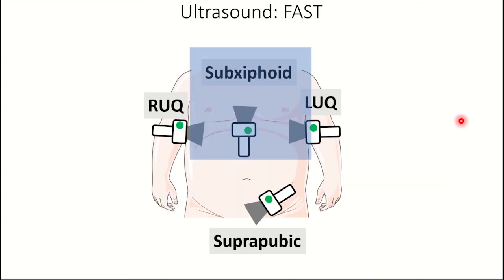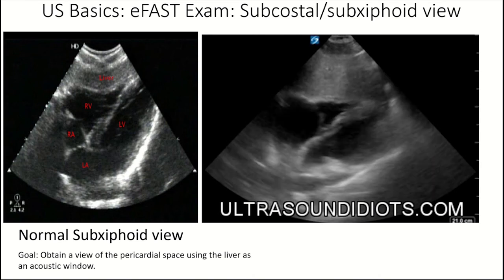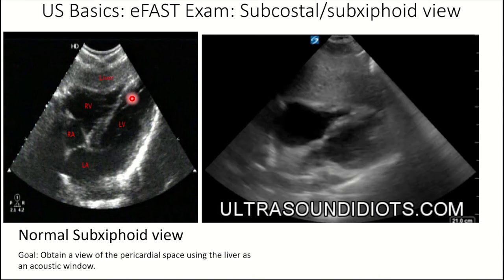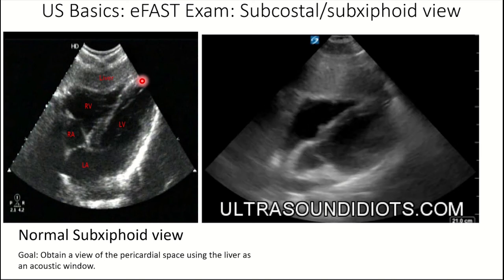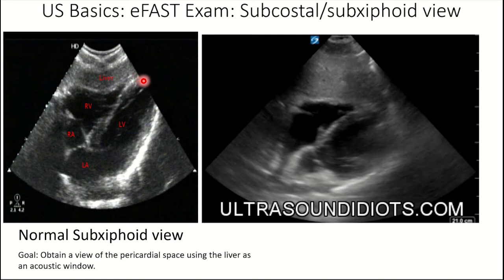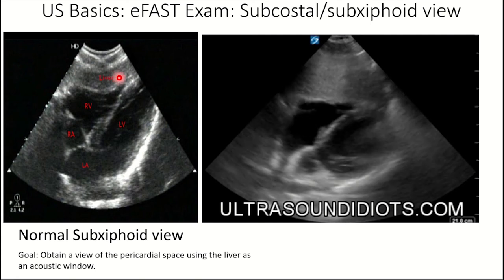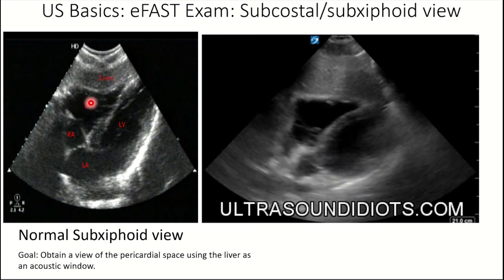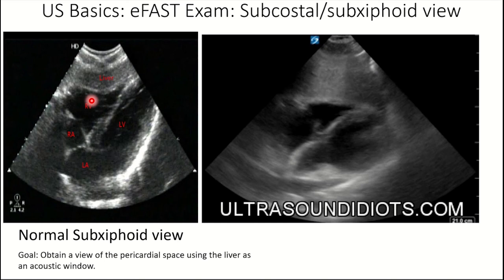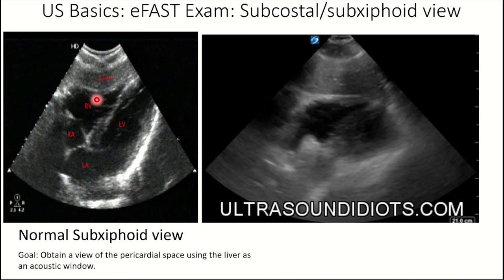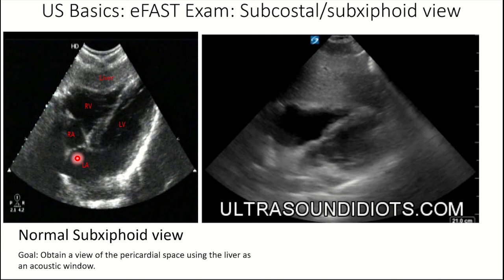Now the sub-xiphoid view. Here is a normal sub-xiphoid image — you're using the liver as an acoustic window to get a view of the heart and pericardial space. Because this is trauma, you're looking for cardiac tamponade and effusions. Here's the liver, and because the thing closest to the skin is always towards the top of the ultrasound, the right ventricle is closest to the skin — so here's always the right ventricle, then the left ventricle, right atrium, and left atrium.